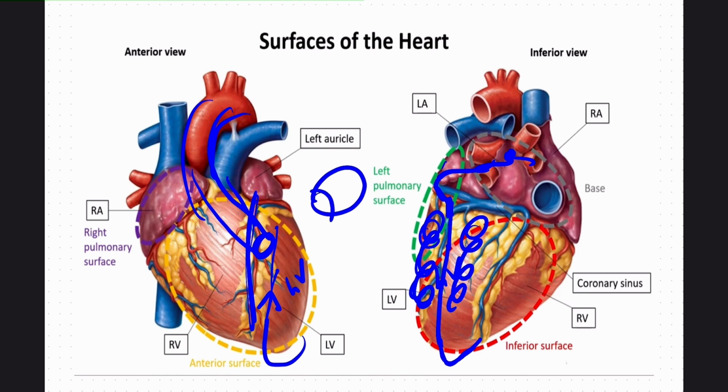The aorta has right and left aortic cusps. Cut through the left aortic cusp. You will cut through this left aortic cusp, enter the ascending aorta, and eventually the arch of the aorta. So you should take care not to cut the anterior mitral leaflet or the interventricular septum.